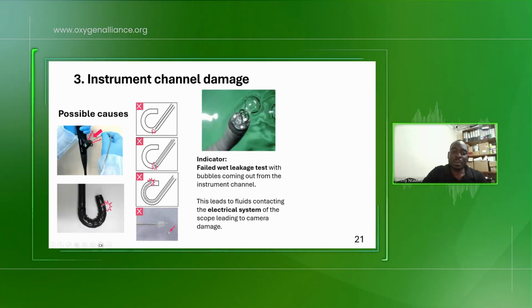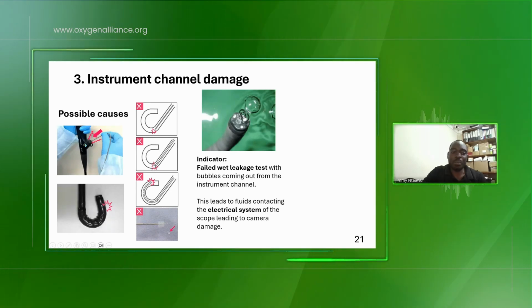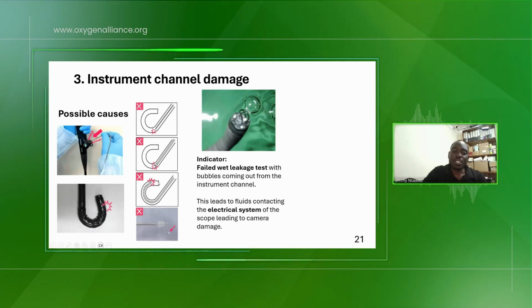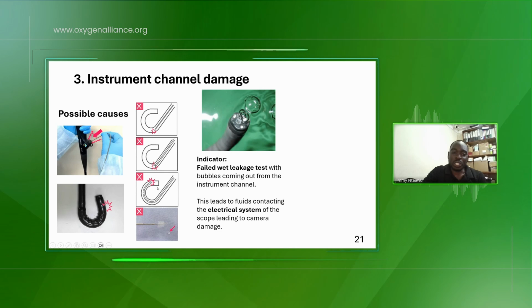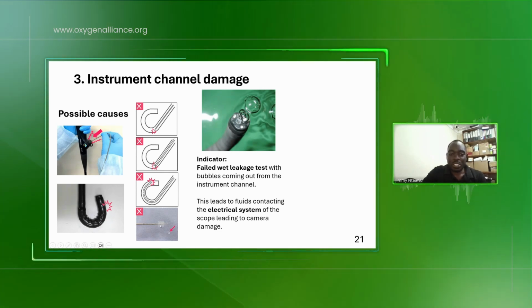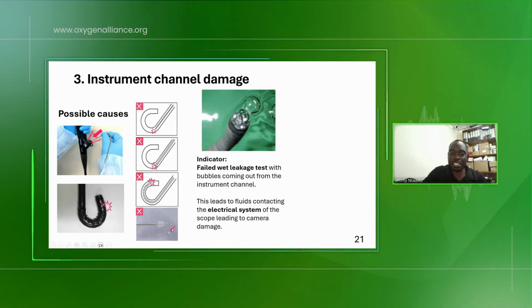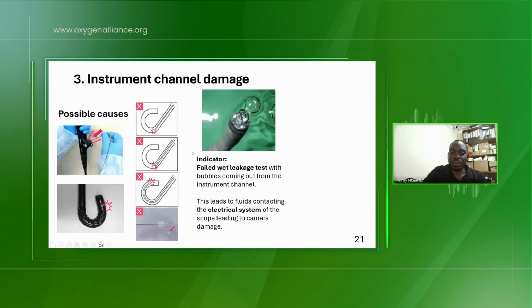When you open, this is a biopsy forceps. They opened it before it came out of the scope, it also punctured the scope. Also, when you overbend the scope when you're passing the instrument, it is going to puncture the walls of the channel and it's going to cause problems. Also, the cleaning adapters we use usually have safety at the tip, so ensure that the safety is on before you go ahead and use the brush.